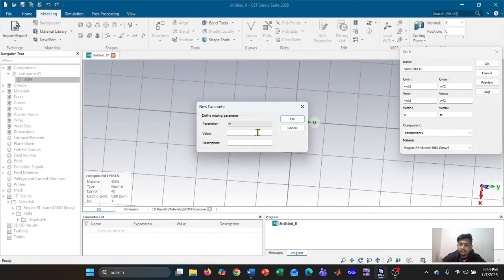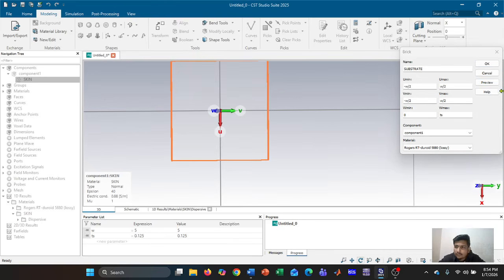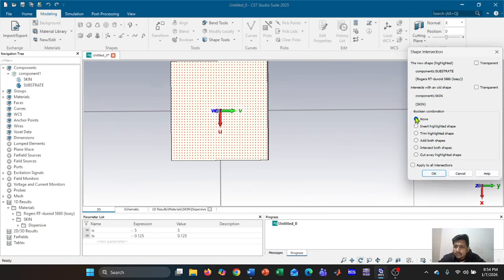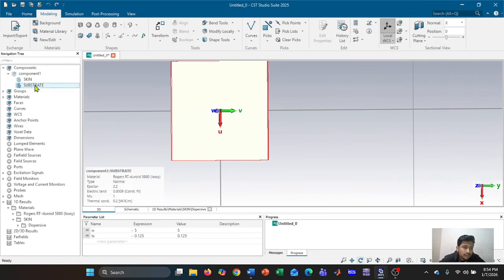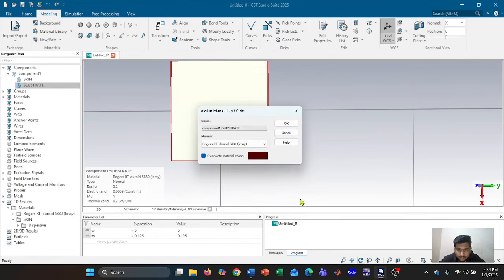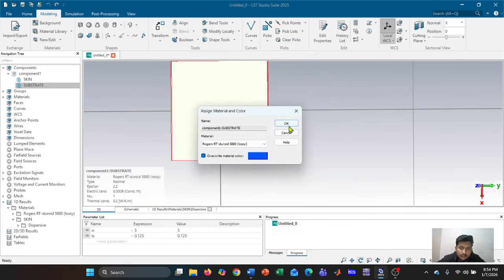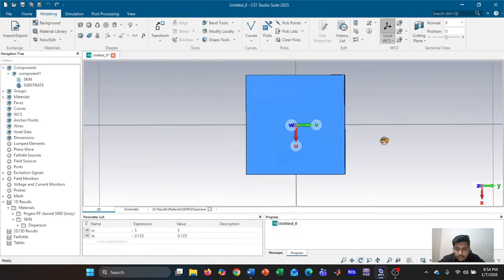Now put the value of W, as I am going to design 5 millimeters, so I am going to enter 5, and the thickness of the substrate is 0.125. Okay, so this is our substrate. You can see. Click OK. Click none. Okay, so I'm going to change the color of the substrate. Let me change to brown. Okay, now let's see, change to blue. You can select any color, it does not matter.